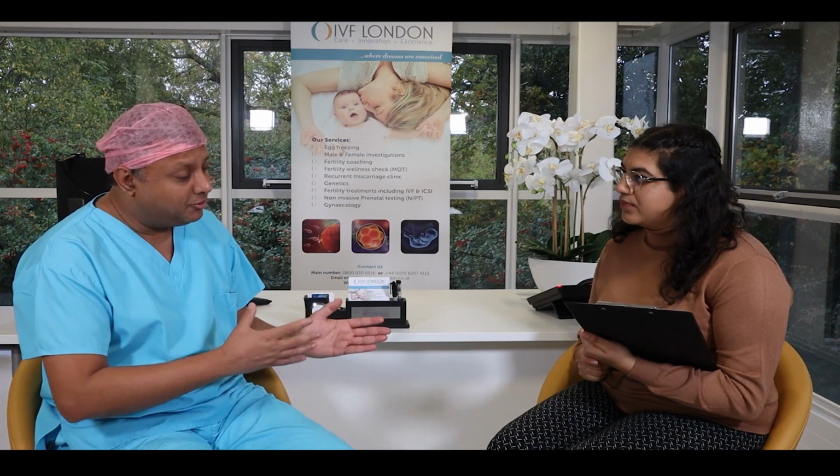Traditionally, as embryologists, we are trained to look at the embryos daily. Once a day, when we look at what exactly they're doing after the stage of egg collection. So once eggs are collected, they're inseminated with the sperm. Then the next day we come and check how many are fertilized. Then it's a day-by-day assessment for up to 5 to 6 days to look at the pattern of development of the embryo. So embryologists are trained to be looking at these embryos daily, looking at the number of cells there are in the embryo and the amount of fragmentation that makes the embryo a good quality embryo, average quality embryo, or a poor quality embryo.